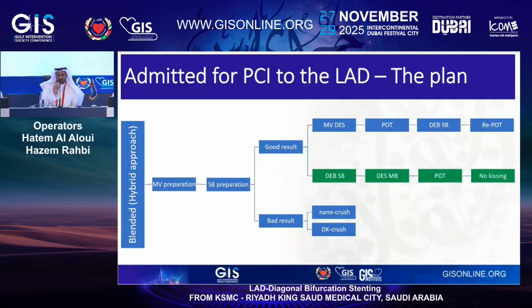We don't see the IVUS, sorry. Latest iteration from, you don't see the IVUS. Can we please ensure that they can see the IVUS?